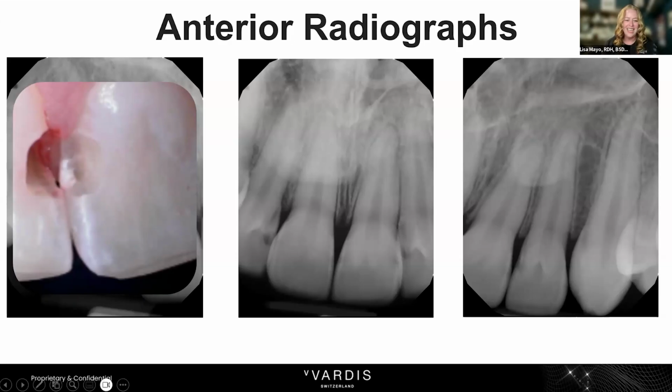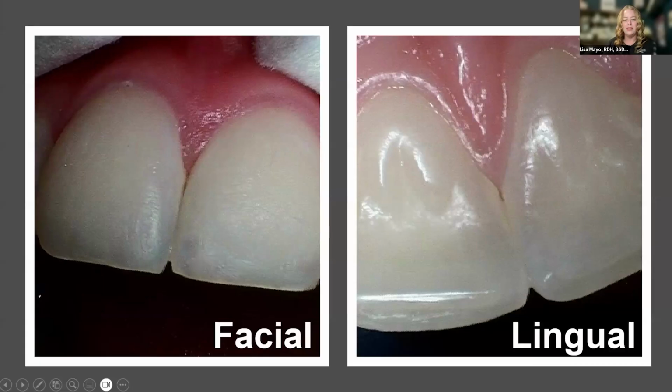I'm working on my kid. So we apply Curodont Repair Fluoride Plus into the interproximal space of 8 and 9. Let me show you what 8 and 9 visually look like.